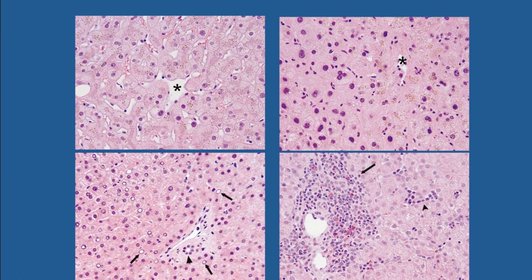Now, the other thing that we might see in a normal liver biopsy are these glycogenated nuclei. We always talk of glycogenated nuclei as being increased in diabetes or other cases of non-alcoholic fatty liver disease. But one must remember that these are pretty common in children and teens up to the age of 15 years.